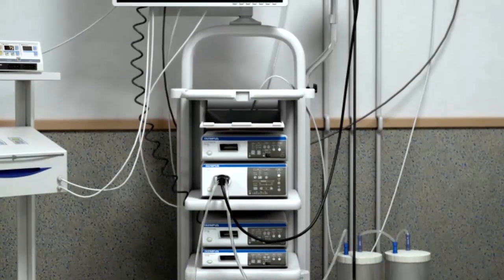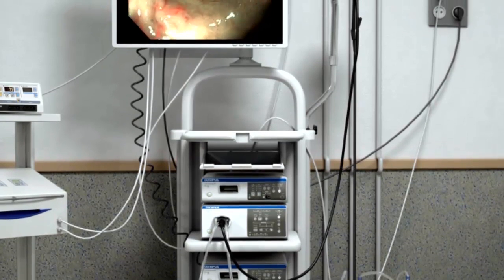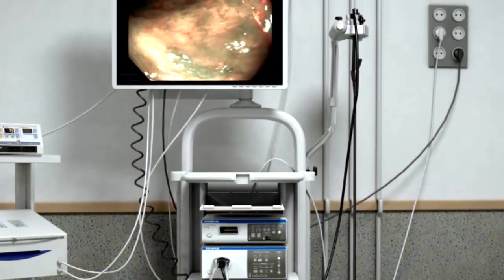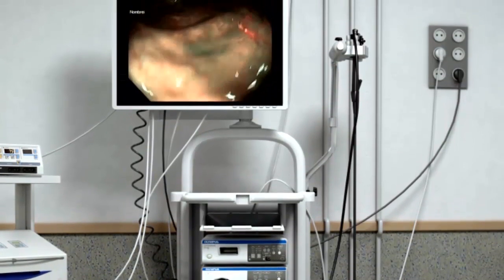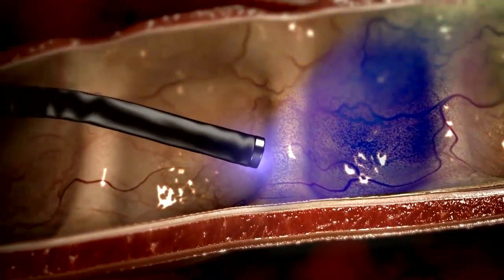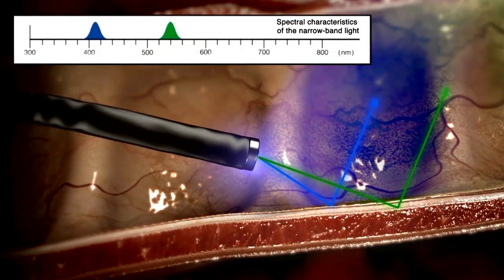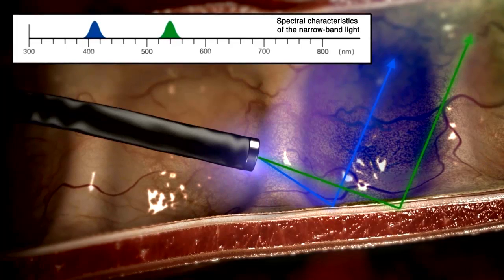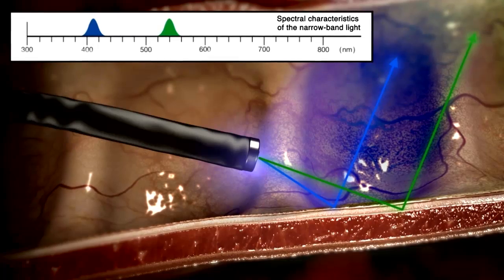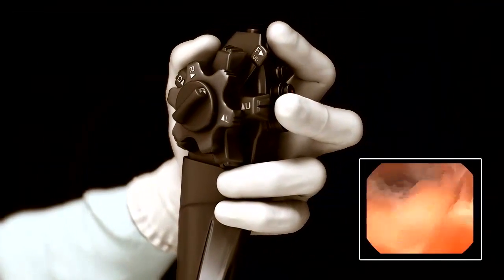At present, there are 3 chromoendoscopy techniques performed without dyes, called virtual chromoendoscopy, although its use in monitoring inflammatory bowel disease has not proven to be better than conventional endoscopy. Narrow band imaging is based on the modification of broadband light emission. It uses filters that narrow the wavelength of the light to the blue and green spectrum, enabling visualization of the capillary pattern of the colonic lesions and its architectural modifications. This system is included in a conventional colonoscope, where the NBI option is selected by pressing a button.